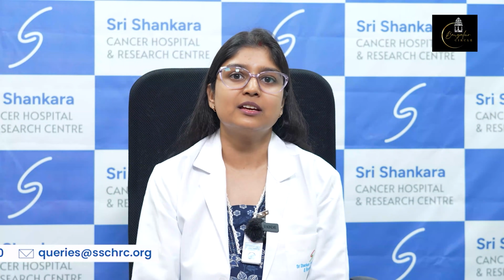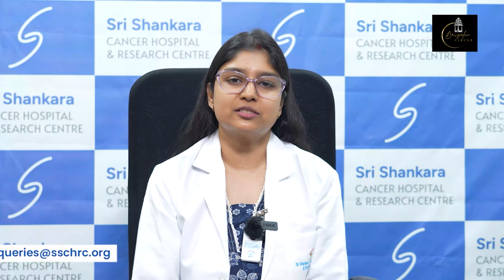In patients who have symptoms but we are not able to understand what the disease is, or where the biopsy can be done from, even in these patients PET-CT helps in detecting a site for biopsy. So these are certain indications where PET-CT is done in cancer patients.